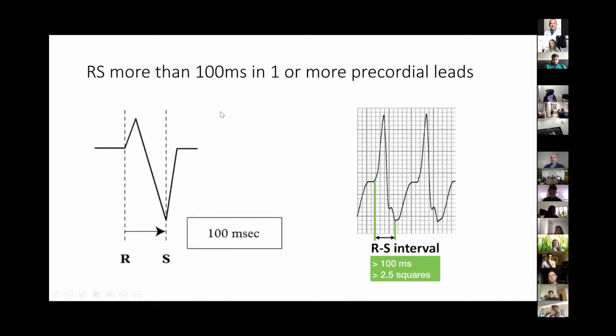And then later it's going to become slurred because you're going to encounter one of those obstacles like a left bundle or right bundle or some delay in conduction. So that's the fundamental difference between these purely ventricular rhythms compared to SVT.